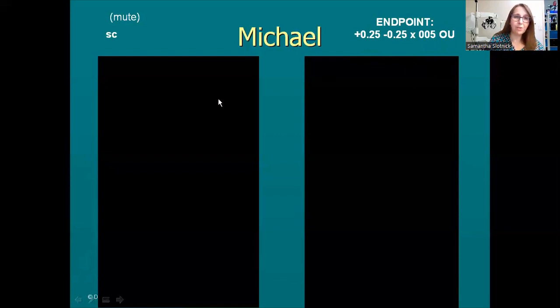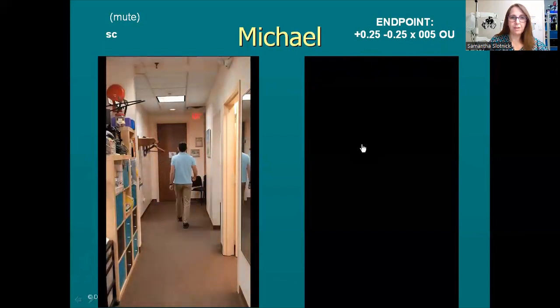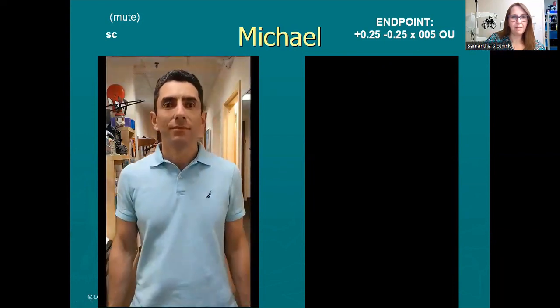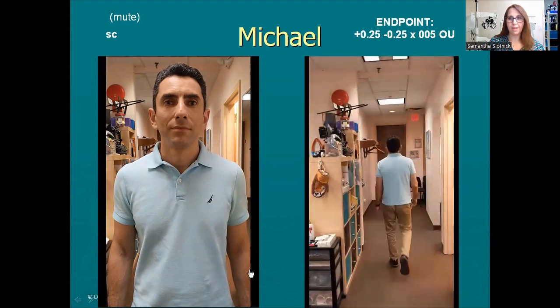So you'll see Michael here, and he is moving, first of all, with his natural gait. He doesn't wear glasses. And he came to me. There were some problems posturally that were identified as something that the vision was really the interference. So I'll have him pause here, and you'll be able to see this is him in the final prescription. And there's much more freedom of movement there. And I'll do this again side by side so you can see.